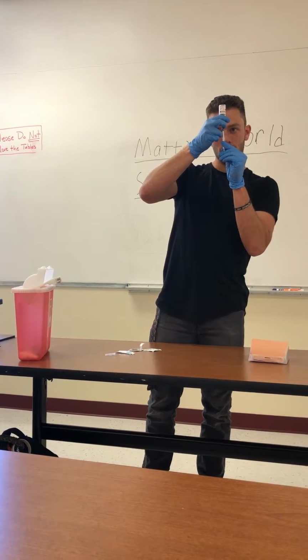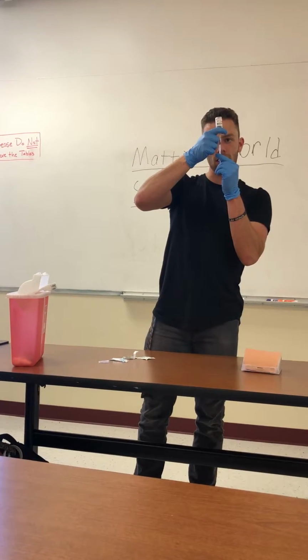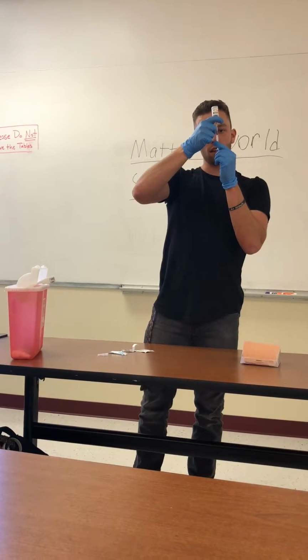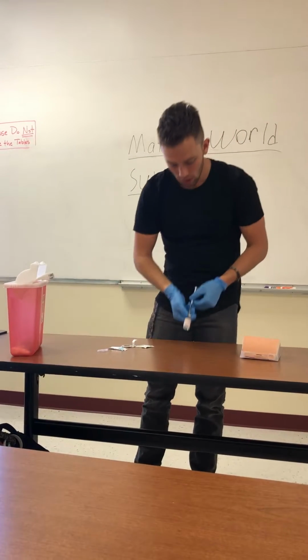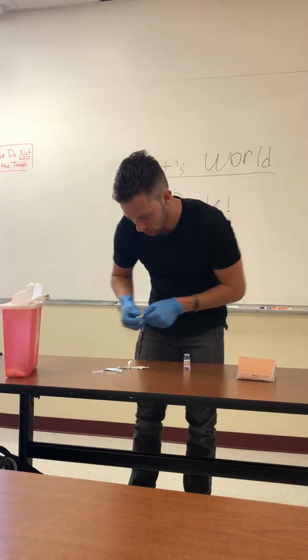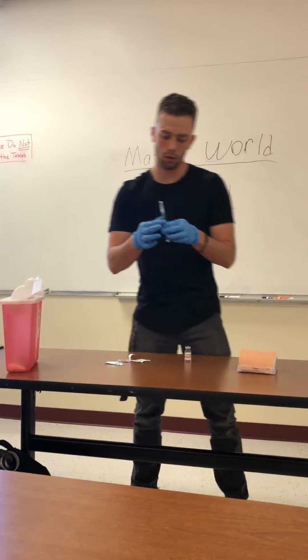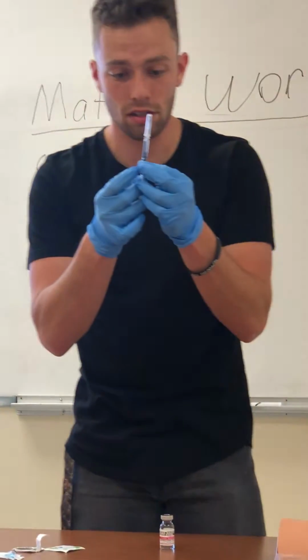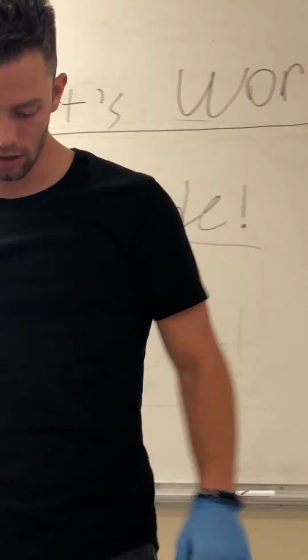Now, this will be the second time that I am checking my medication to make sure it is right. Along with this time, I will undo my needle and scoop it up. At this time, I would also check with other nurses, ask them, hey, is this the right amount? To me, that looks like the right amount. What do you think? Alrighty, that's good.